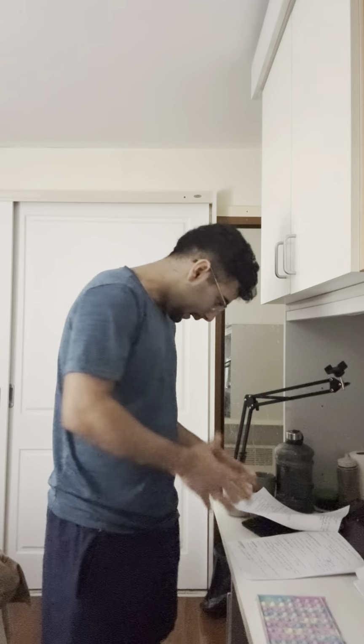Right, so I'm going to do hand hygiene. I'm going to ask for the allergies. As I said, hi, my name is Hansel. I'm going to be your nurse for today. How are you doing? Is the bed height okay for you? Is the lighting okay? Do you want to go to the washroom before I start the procedure? And all of this stuff, right? You did the three-point check plus an additional allergy check as well.